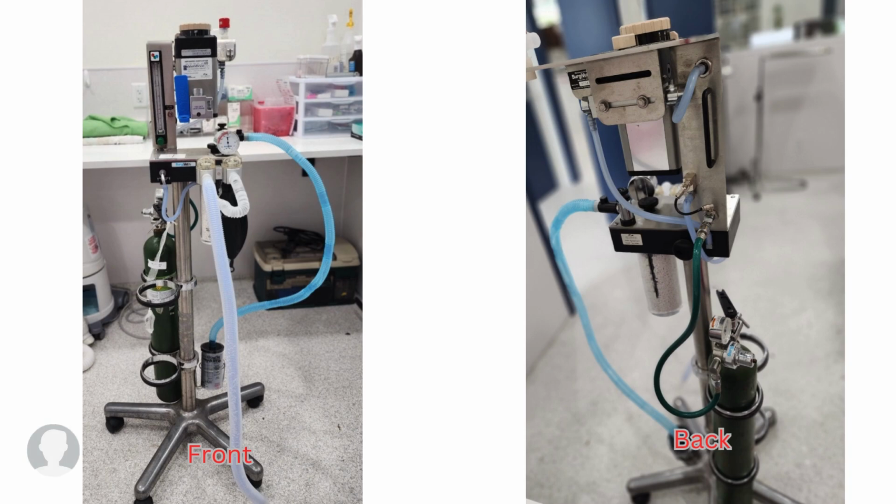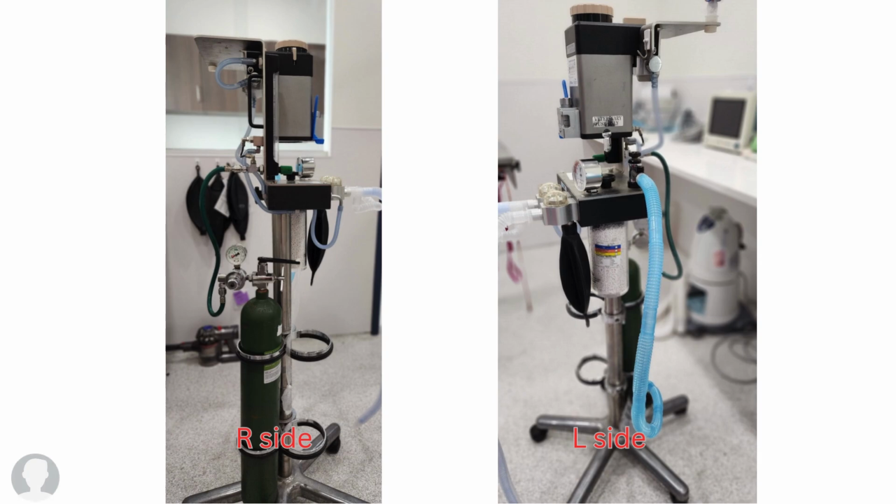When you're in the preparation room, the first thing you must do is look at your anesthesia machine. Look at it in the front and in the back. Look at it in one side and then in the other side. You want to identify the pieces attached to it, the type of oxygen tank, what type of breathing bag you're going to be using, and what system you will use. Try to identify the scavenging system and the CO2 canister.